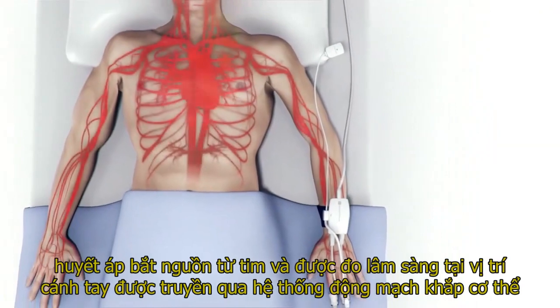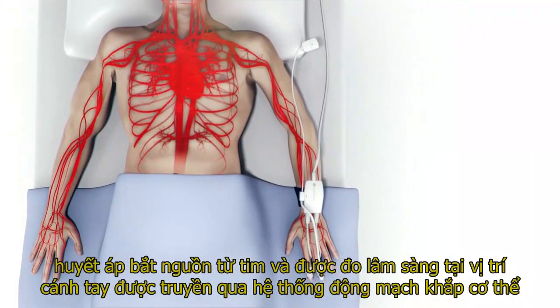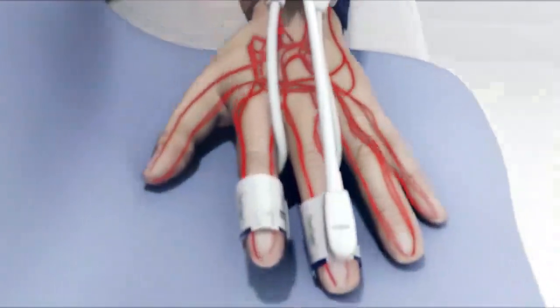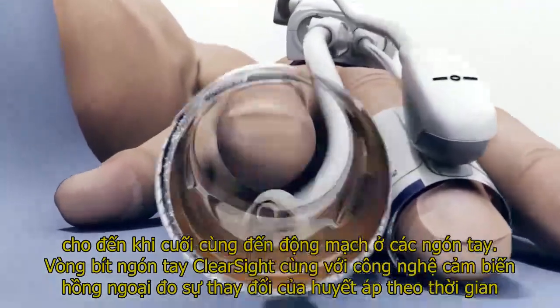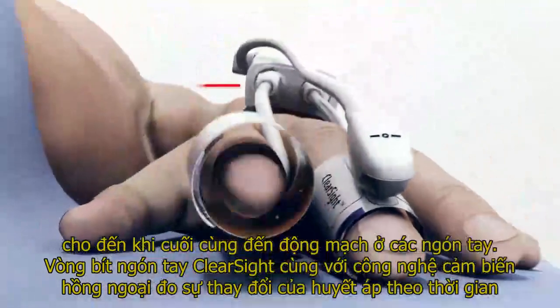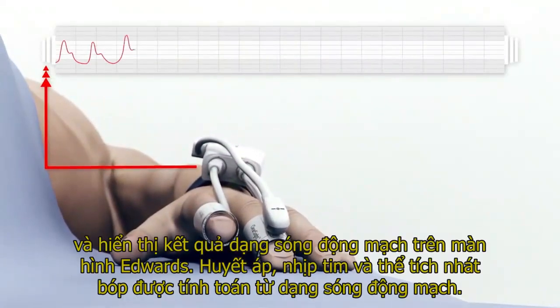Blood pressure originating from the heart and clinically measured at the brachial site is transferred through the arterial system throughout the body until finally reaching the arteries in the fingers. The ClearSight finger cuff, along with its infrared sensing technology, measures blood pressure's variation over time and displays the resulting arterial waveform on the Edwards monitor.